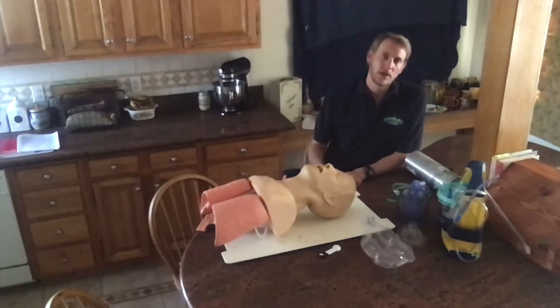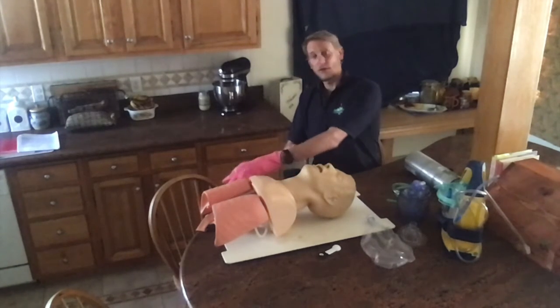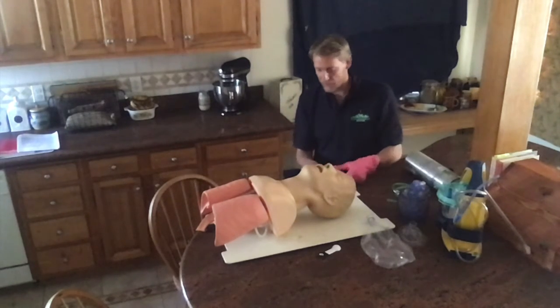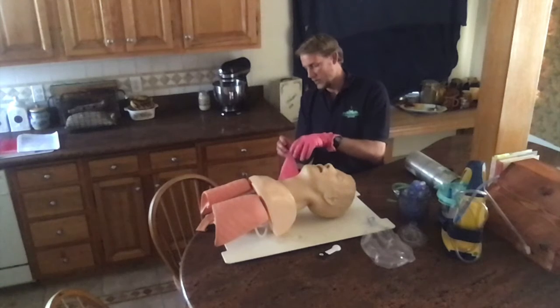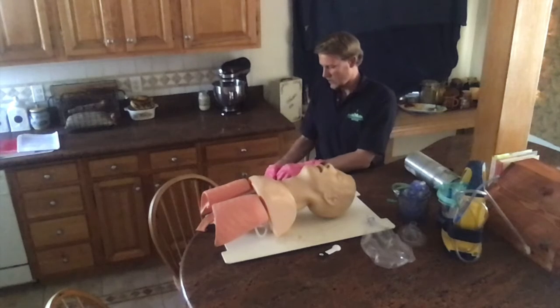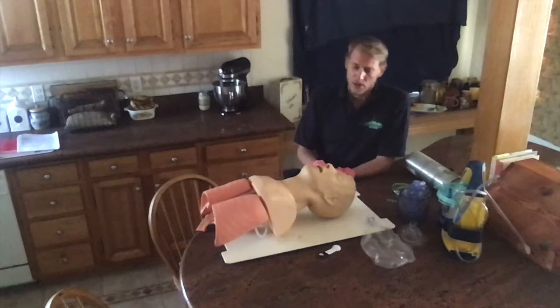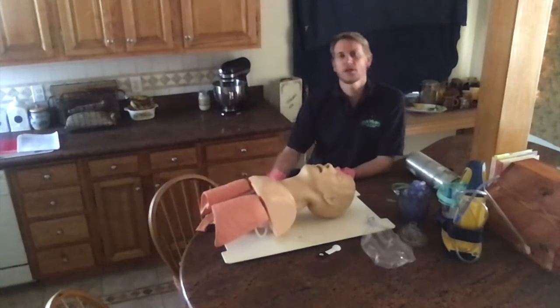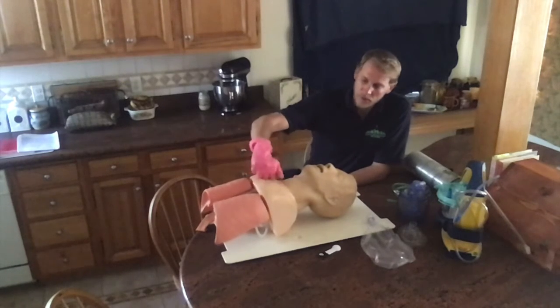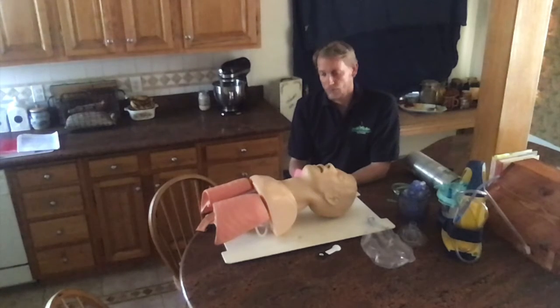I am ready to begin BVM ventilation of an apneic adult patient. I'll put on appropriate PPE while assessing the scene for safety. It looks like I have one patient. I'll approach — sir, are you okay? Sir, are you okay? Patient is unresponsive to verbal. I'm going to give a sternum rub to apply painful stimulus, and the patient is unresponsive to painful stimulus.